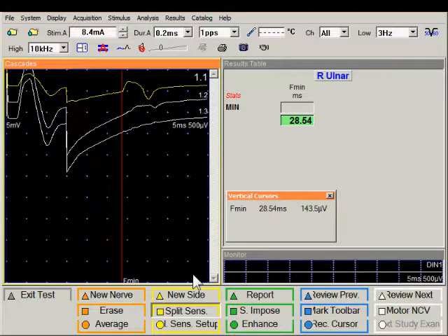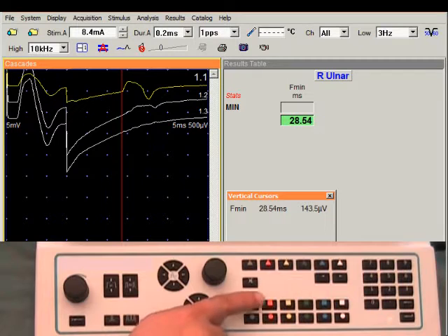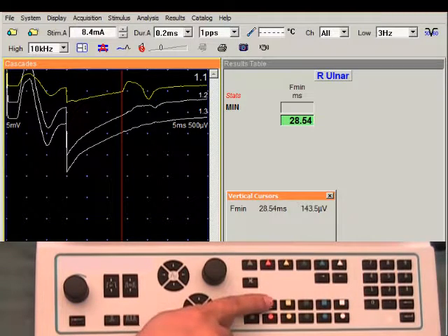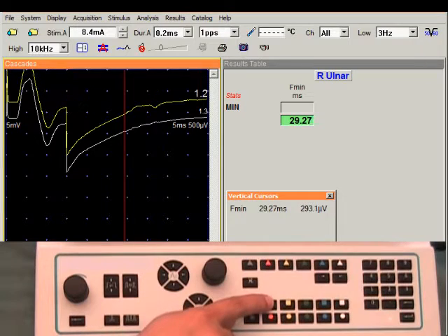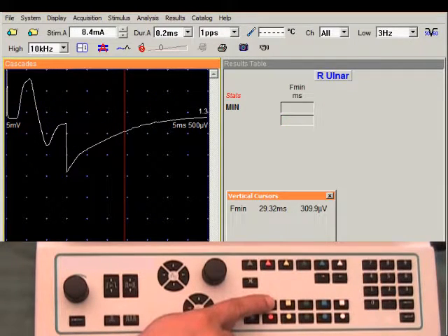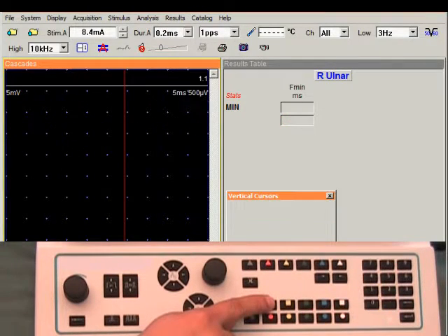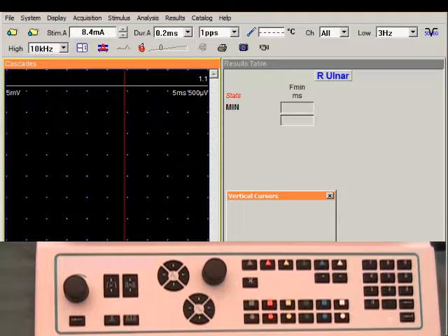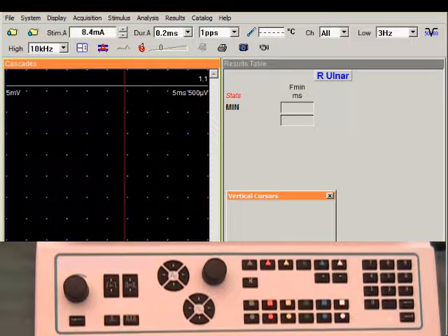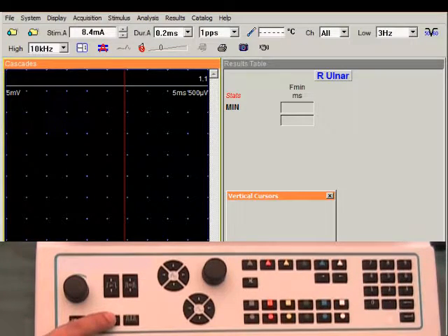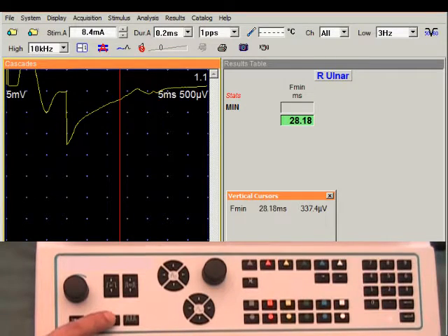And that one did not change much. I'm going to press the orange square key for erase. I may have to press it more than once to erase all my traces.